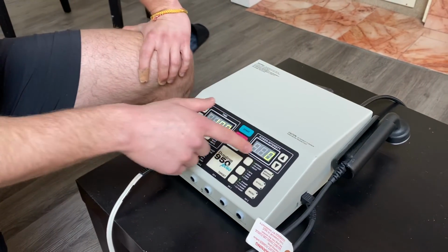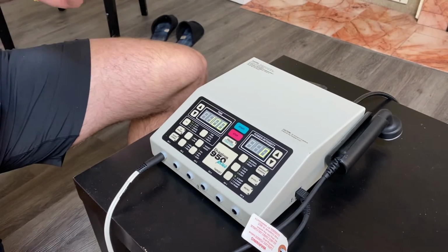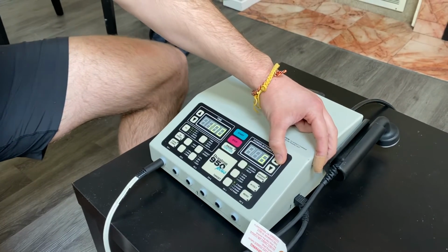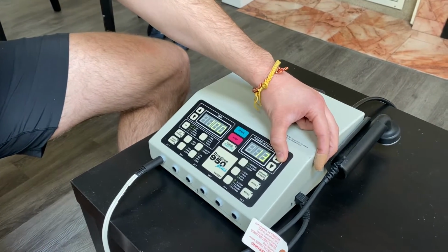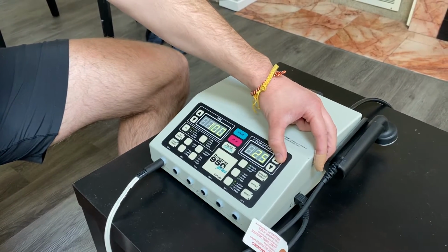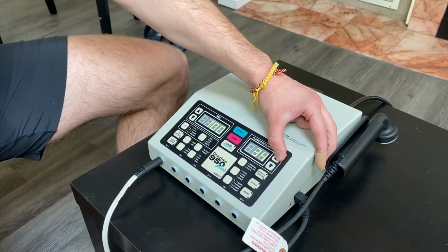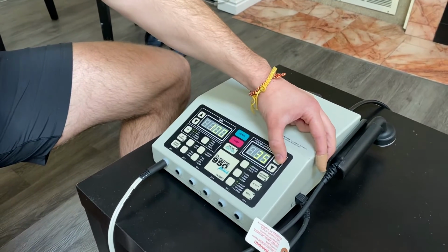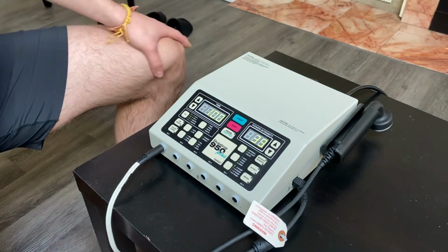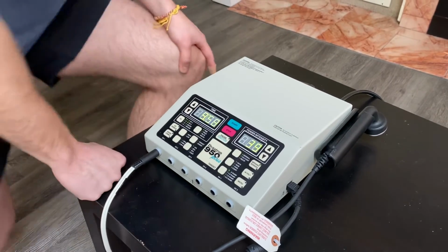And now I'm going to start the intensity. So Will, I'm just going to start raising the power up a bit. I just want you to tell me when you start feeling that buzz, okay? Starting to feel it at all? Very little. Very little, okay. So we'll keep going, and you let me know when it's just kind of a comfortable tingling. A little more. Right there is good. Okay. Great. So now we can go ahead and start that, and the timer's running down.